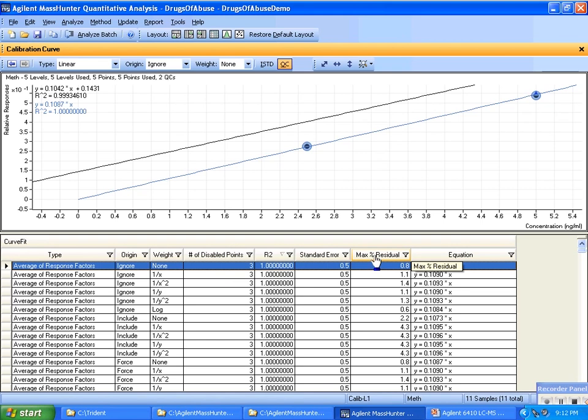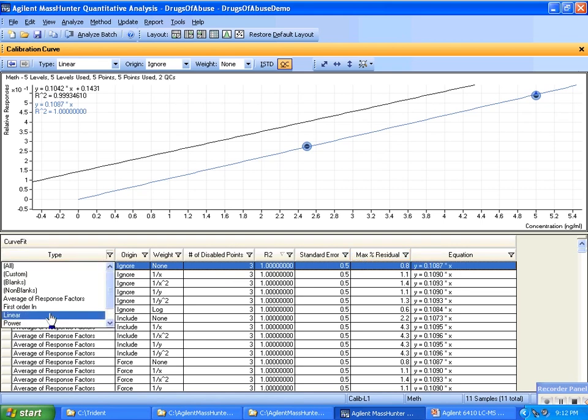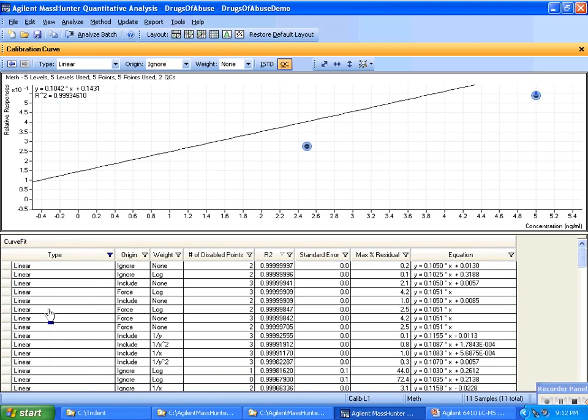Now, based on my SOP, I'm going to decide only to look at the linear. So I restricted my CurveFit to linear. And I've also decided that I don't really want to end up disabling any of the points, so I'm going to go for disable no points, filtering that out. So looking at my choices here, I've got linear ignore, which I pointed out has a decent R-squared value. But I still don't fit the lower points because there's no weighting to that.